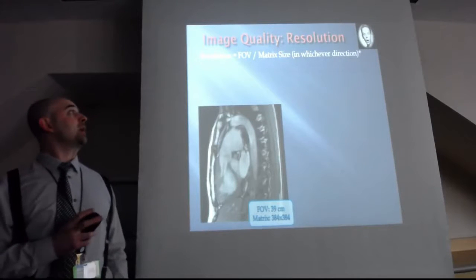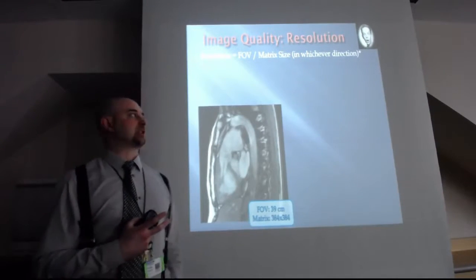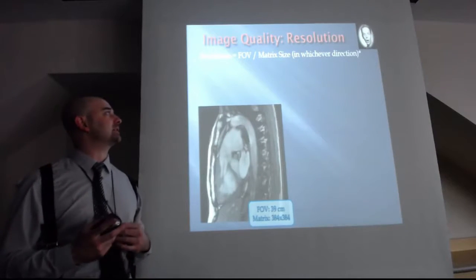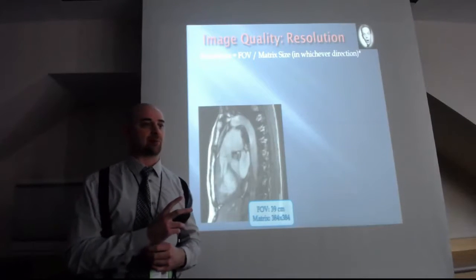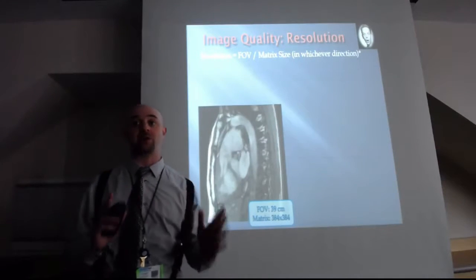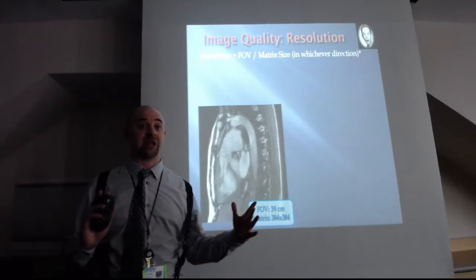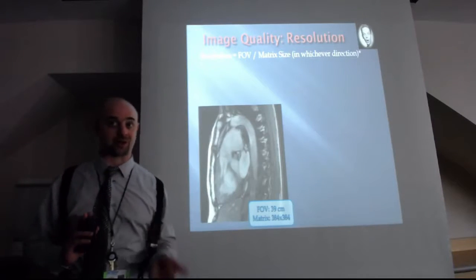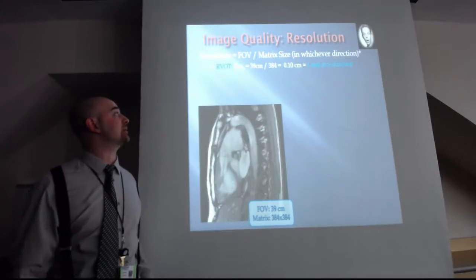All right, let's look at resolution and actually defining a resolution. Don Knotts has returned, and that's because there's a kind of a complicated issue here with resolution. For the purposes of our discussion and for your tests, you should treat it as if spatial resolution can be separated. So you can have different in-plane spatial resolutions in the X direction and Y direction. And that resolution is going to be the field of view divided by the matrix size.